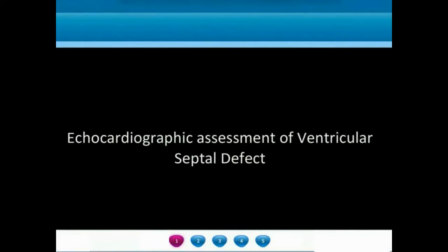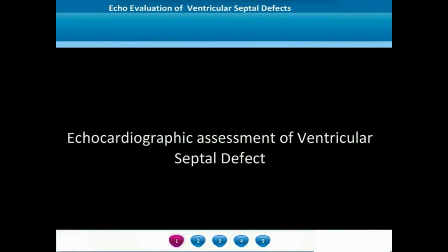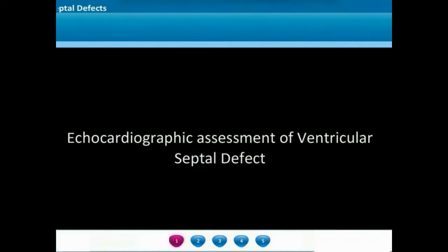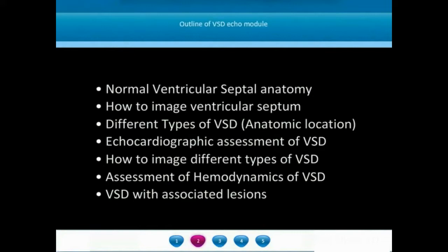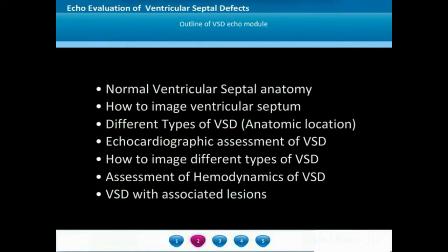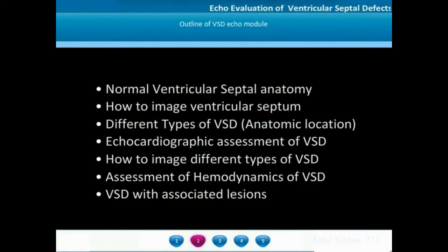Welcome to the e-textbook of echocardiography in congenital heart diseases. In this module, we are going to discuss the echocardiographic assessment of VSD, ventricular septal defects. We will start with description of normal ventricular septal anatomy, how to image the ventricular septum from different echocardiographic views, then move on to different types of ventricular septal defects and their anatomic locations, how to echocardiographically assess them, image different types of VSDs in different views, and assess the hemodynamics of the VSD and associated lesions.